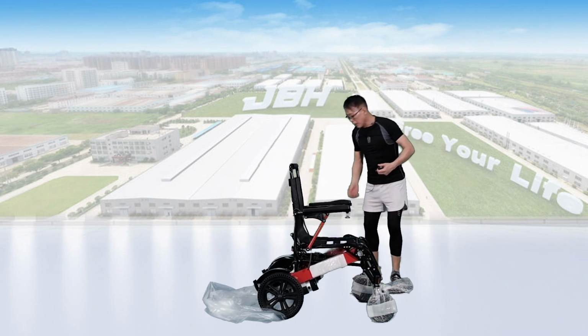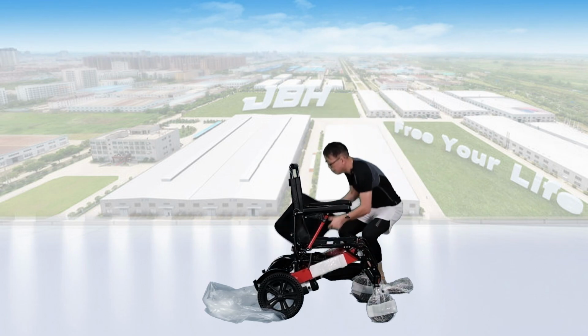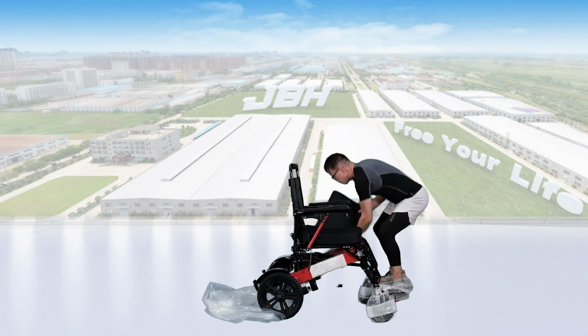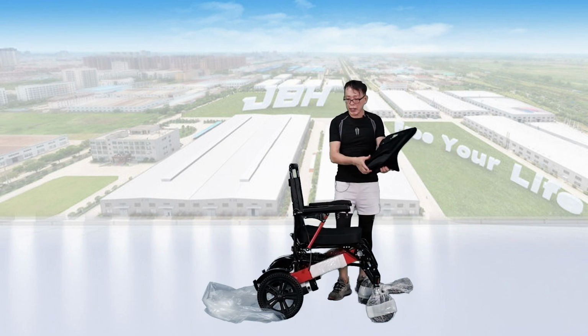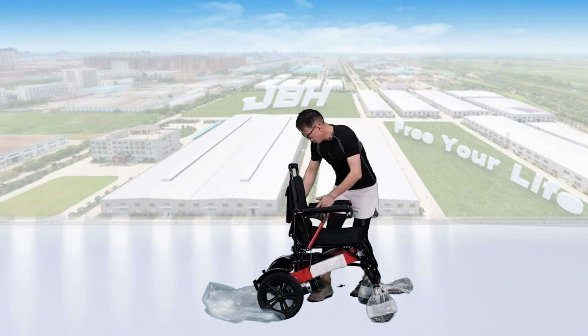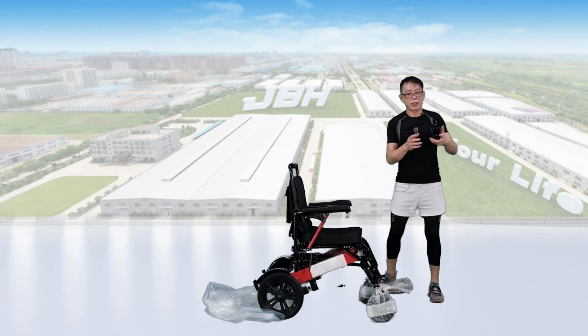up, and then we can set up the seat cushion here on the top of the seat. And then the seat back cushion with the logo to the back, we just insert it into the space here. And the controller is really simple and easy.